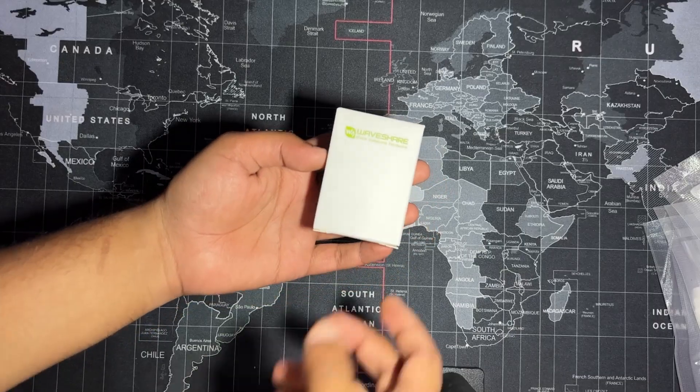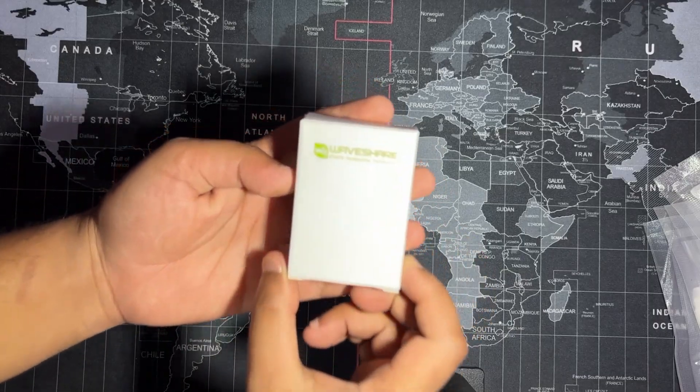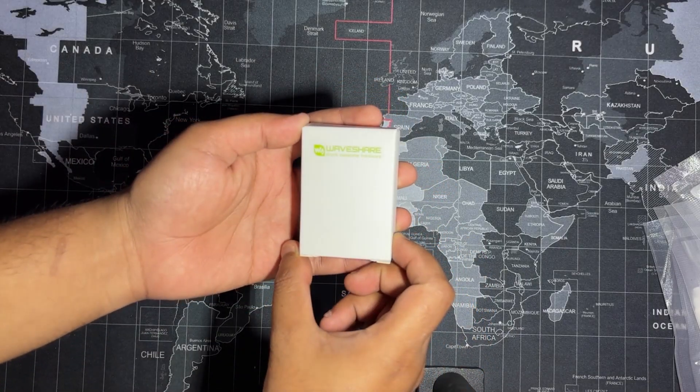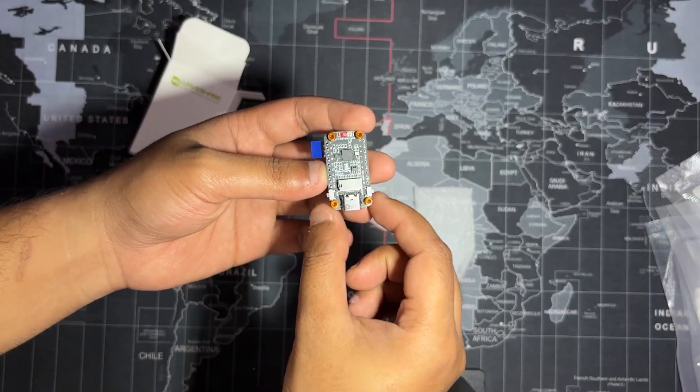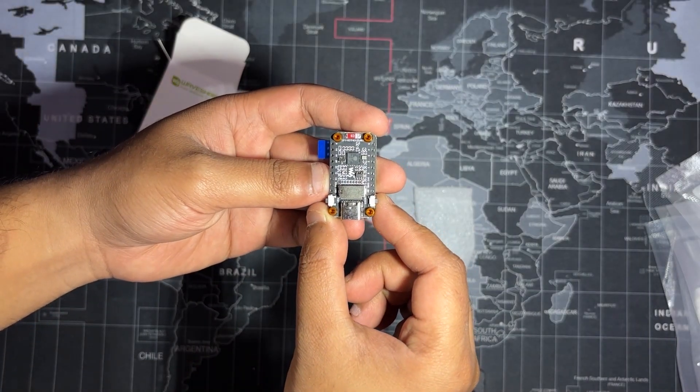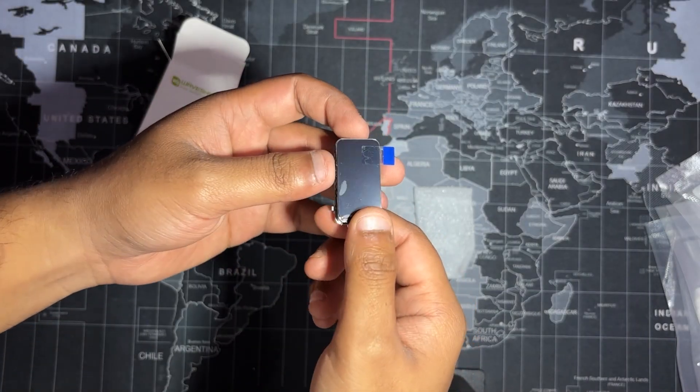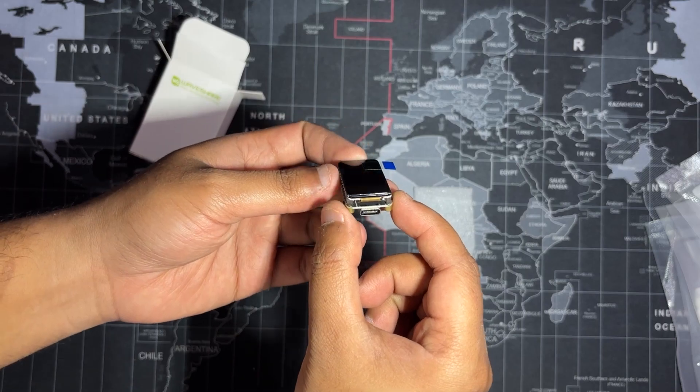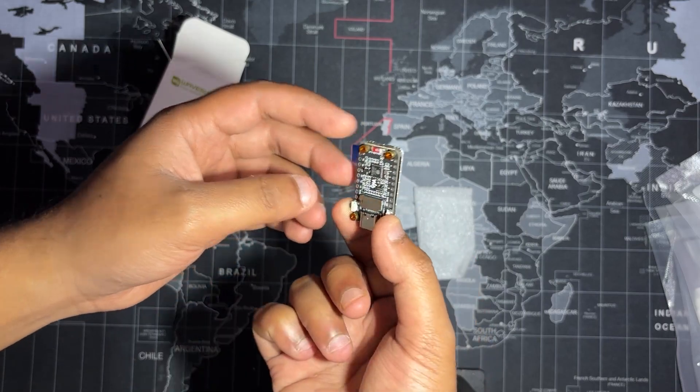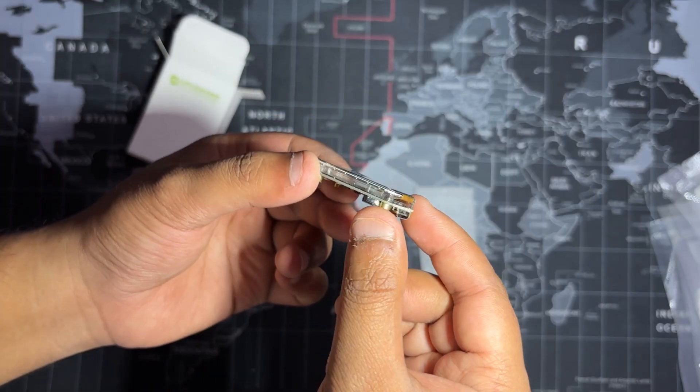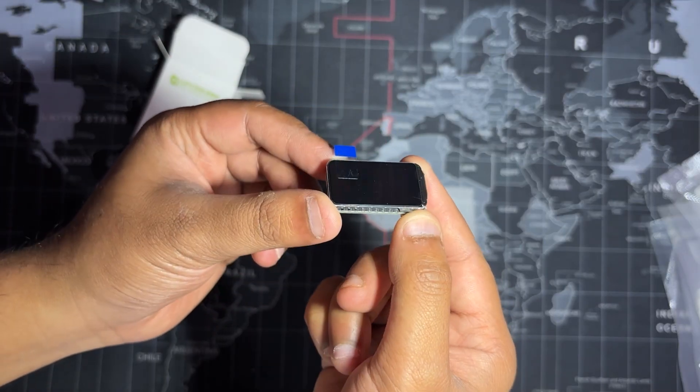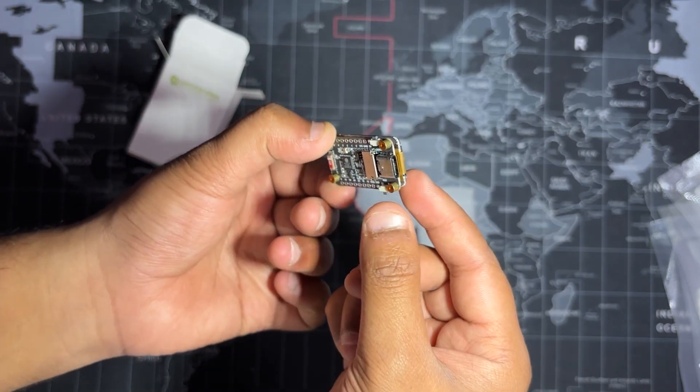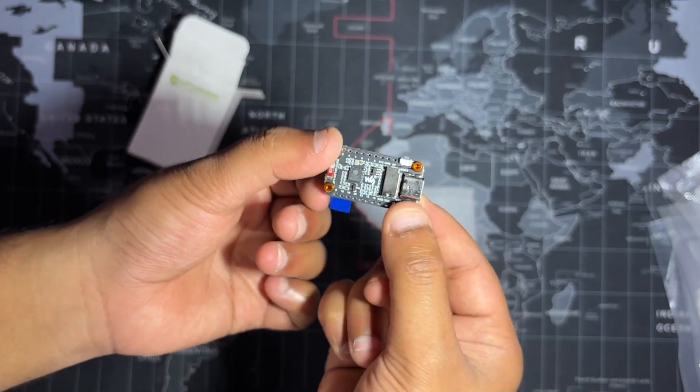For the handheld version of Medic Mini, I switched to a more integrated solution: the ESP32-C6-LCD 1.47-inch display board made by Waveshare. The name might be long, but the board itself is surprisingly compact and packs a lot of power in a small footprint.